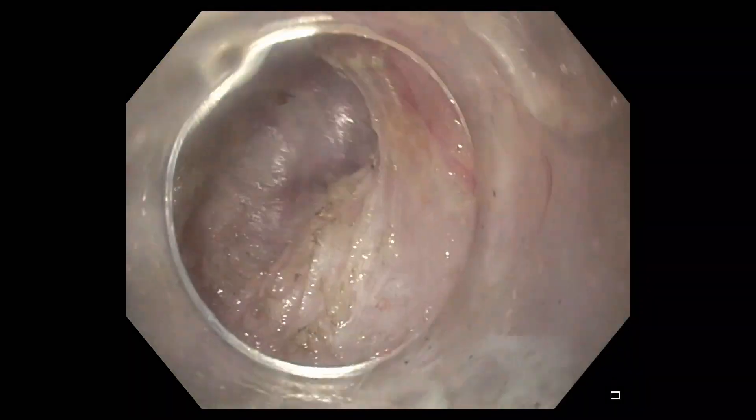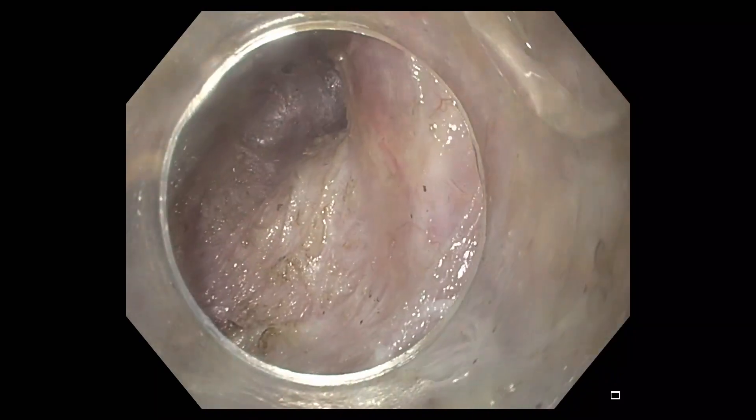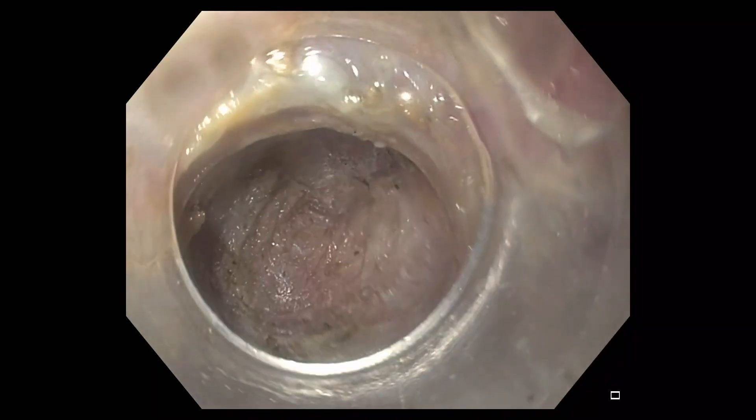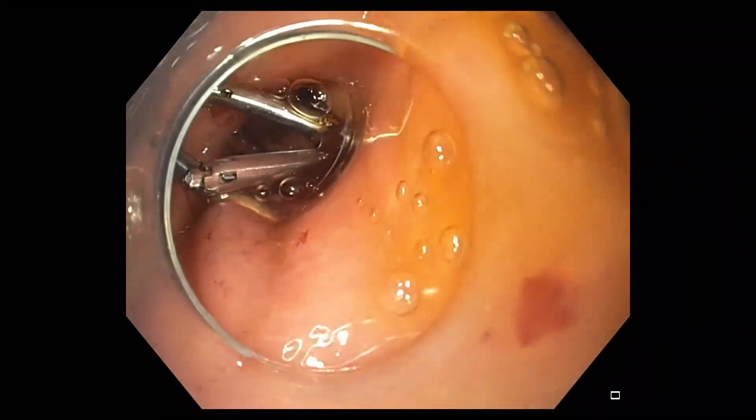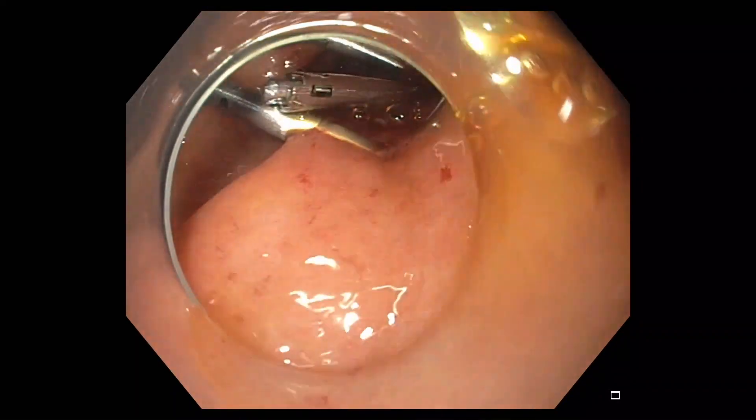As the scope is withdrawn, the tunnel is inspected for any evidence of bleeding from submucosal or perforating blood vessels. Following completion of the gastric peroral endoscopic myotomy, the submucosal tunnel is closed using a series of hemostatic clips.